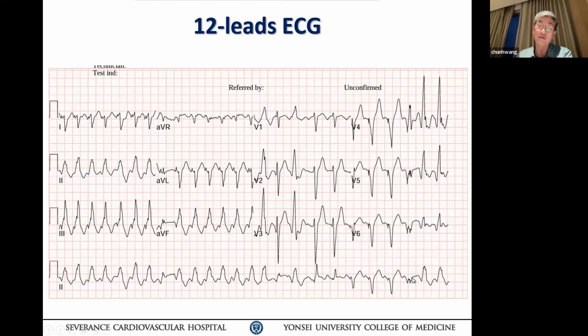Yeah, that one. That's a fusion between the native conducted beat and the paced beat, because your P wave precedes at almost exactly the same timing as the first three complexes. So this is evidence that could suggest a VT, but you cannot rule out the possibility of right bundle aberrancy with the pacing coming on time, merging, becoming fusion. And then it probably also happened on the very narrow complex, the V1 second complex. If you go to the V1 second complex, they're extremely narrow. Yeah, that may be the narrow native complex.